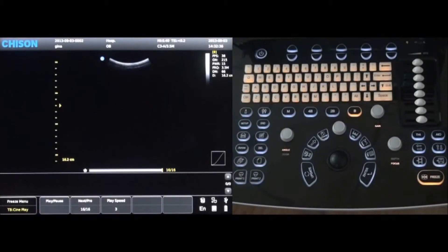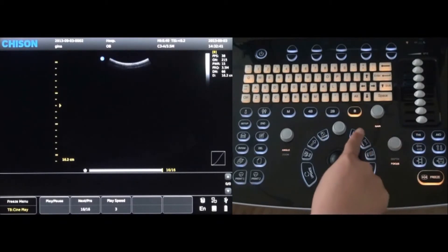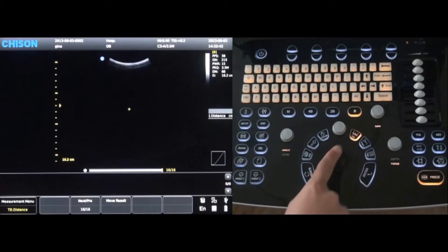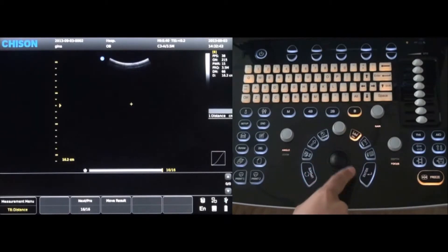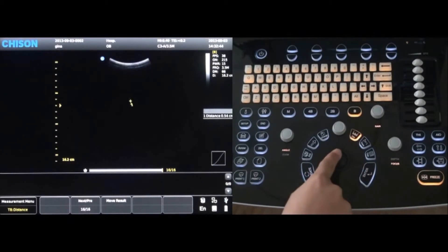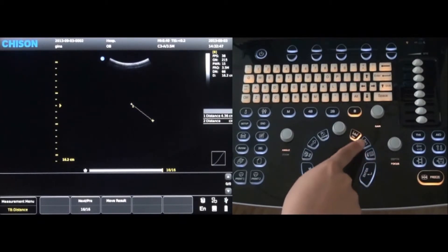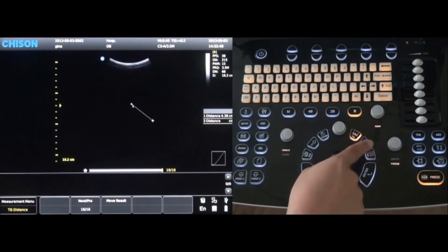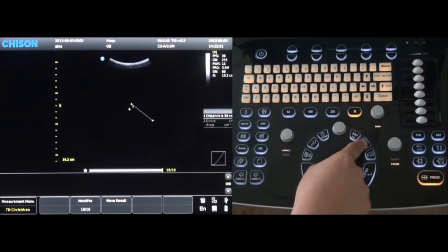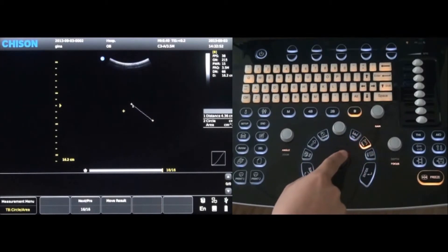Distance measurements can be taken by pressing the distance key. Move the trackball to the desired location and press the enter key — this will create a starting point. Move the trackball again to the ending position and press enter again. The measurement distance is now displayed on the screen.